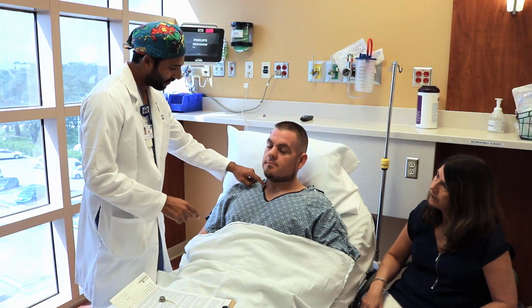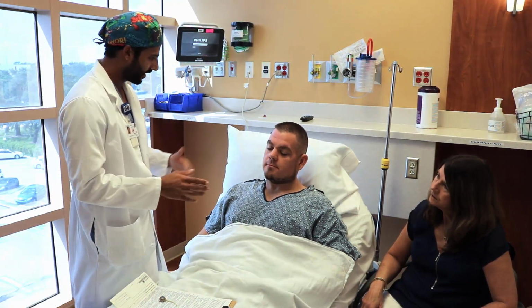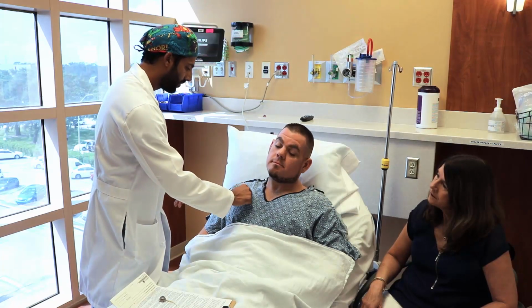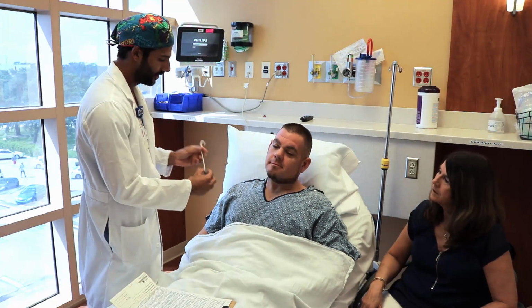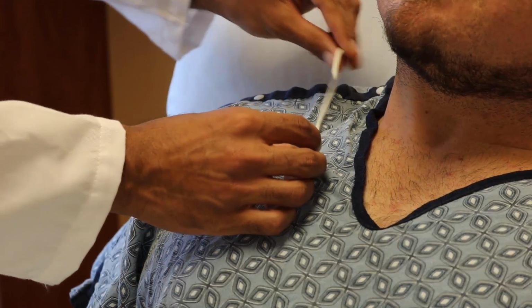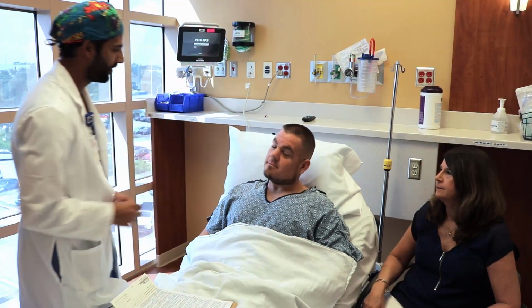So then numbing medication here, and of course you're all cleaned off. We go into the vein right here and put a wire down. And then we leave that wire in place, and I use x-ray to confirm where it goes. And then I make a small incision right here. I make a little pocket for this part of the port. I put the port in, tunnel it underneath the skin, up over the wire and down into the vein. We sew you up and then you're all done.